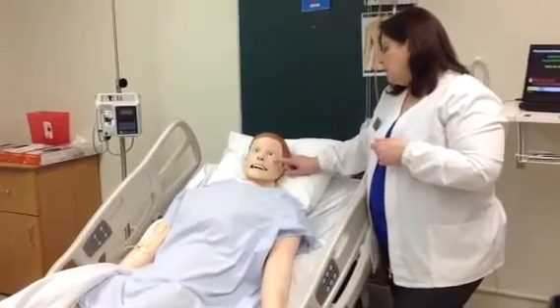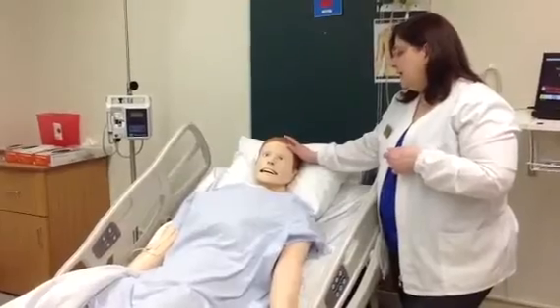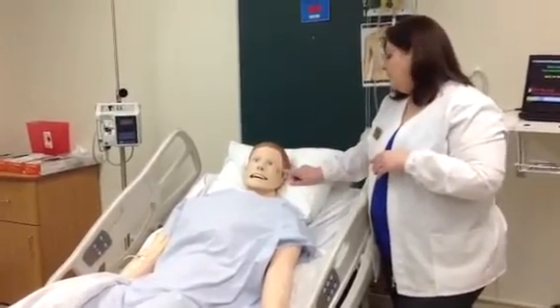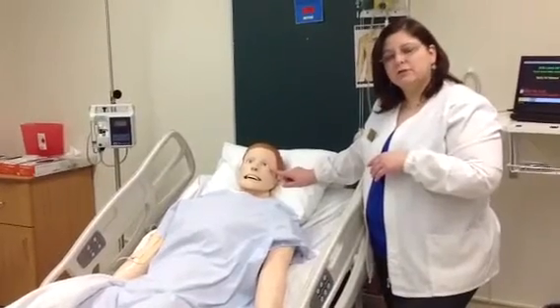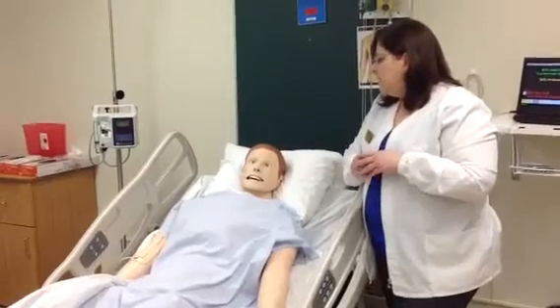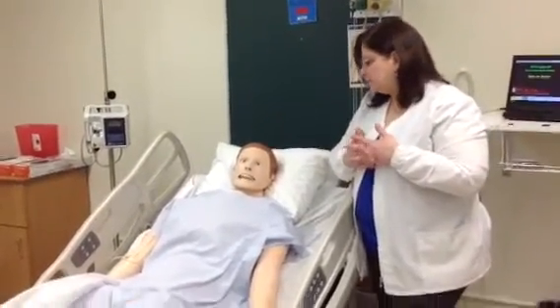But there are also microphones. So SimMan can speak to you. It's actually your clinical instructor, but you will be hearing your clinical instructor talking to you through the speakers in his head. So that kind of helps him to be a little more interactive with you.